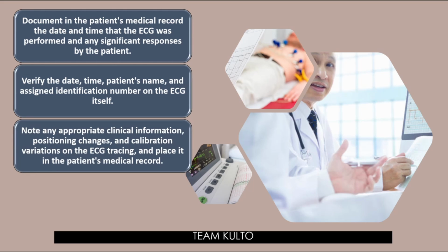Note, bago tayo pumunta dito, bakit importante ito? Kasi malay mo, abnormal yung result or normal yung result, hindi pala yung tama dun sa pasyente mo. Hindi pala yun para kay patient A, para pala dapat yung ECG na yun kay patient B. So you need to make sure na kung ano yung nakalagay na patient information sa ECG strip mo or sa ECG paper mo, yun talaga yung para doon sa pasyenteng yun. Sa chart, attach mo yun sa document ng iyong pasyente, okay? Para maiwasan yung misdiagnosis and mismanagement.